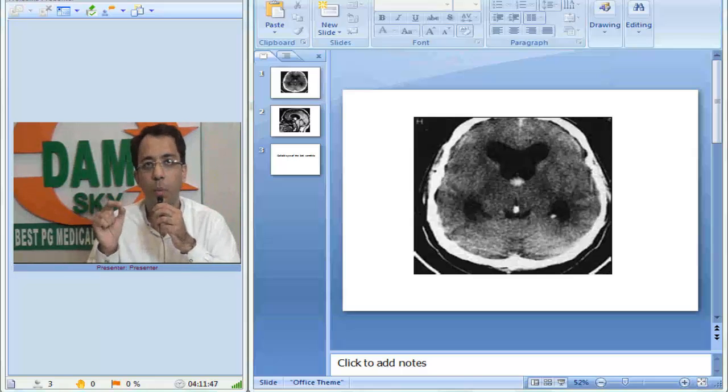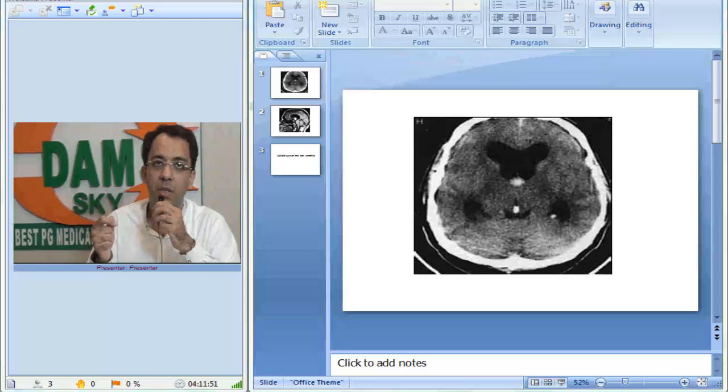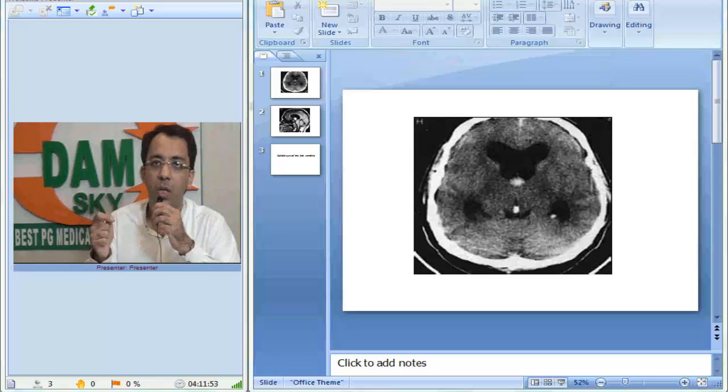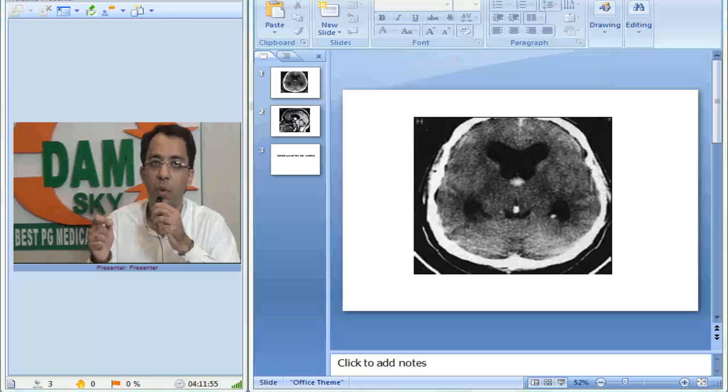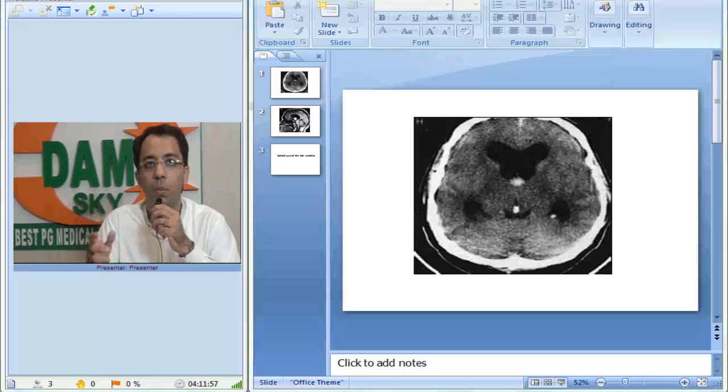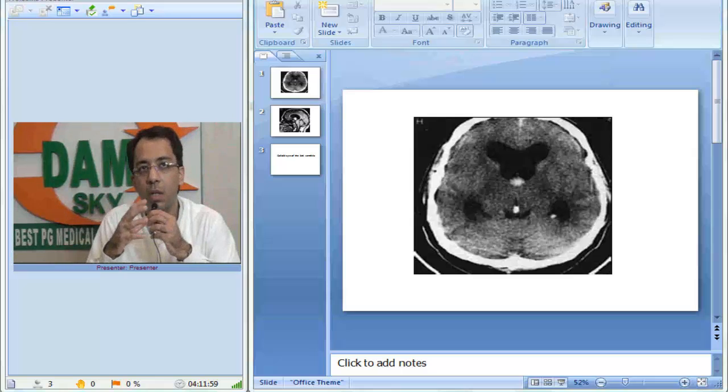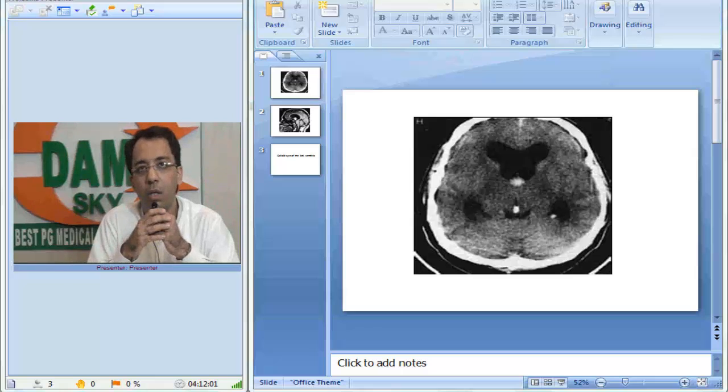Are you able to appreciate? So what will be my description? Hyperdense, well-defined, rounded lesion in the region of foramen of Monroe with bilateral ventriculomegaly, which is in the anterior part of the third ventricle.